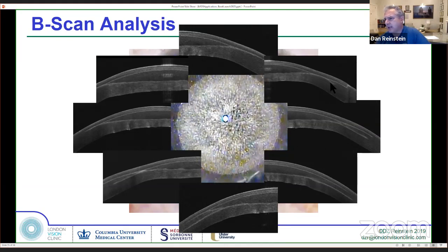there seems to be another cut down here. Well, let's go one further. Ooh, okay. So there's a lower interface, which then doesn't meet with the cap interface, but goes down parallel to the cap interface. Well, that's a false plane, guys. That's a false plane. And we can look at it at another angle where it's really quite far away from the cap interface, which was at 120 microns or something.